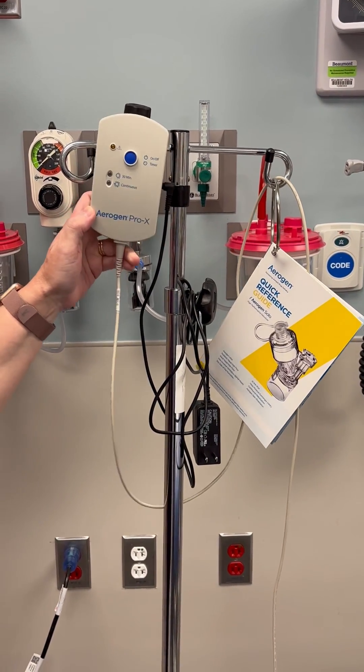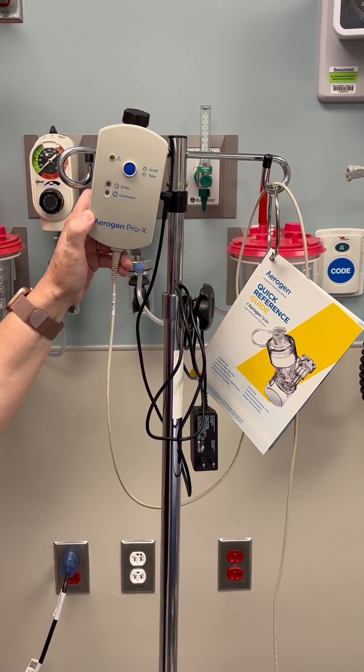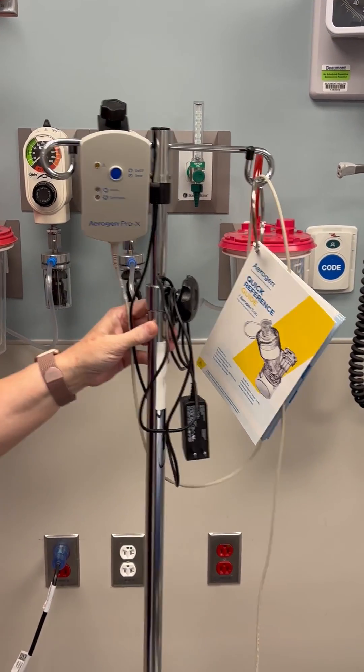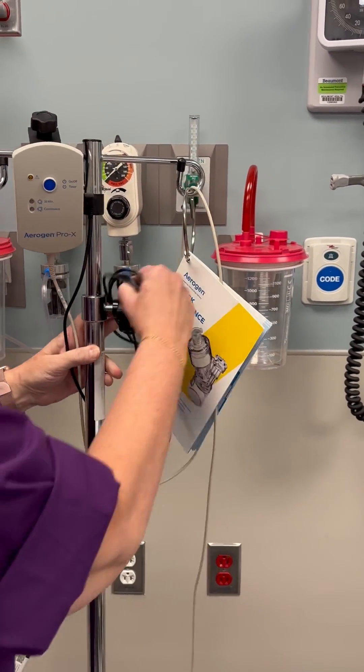Hi. Today we're going to go over the Aerogen nebulized treatments. This is our Aerogen and the first thing we're going to do is we're going to plug this in.